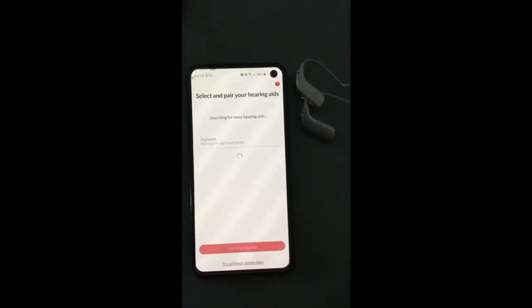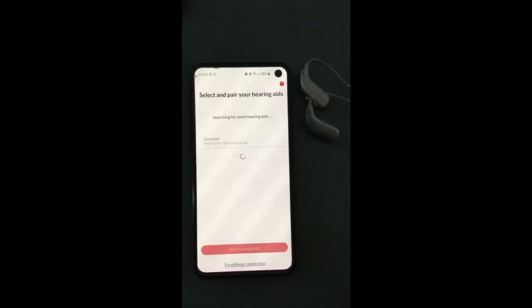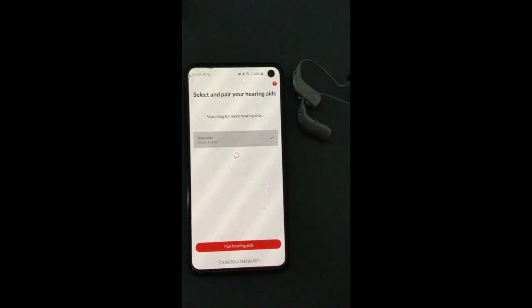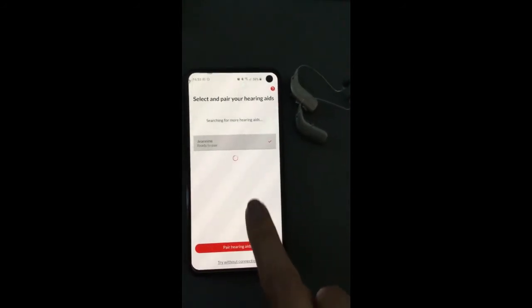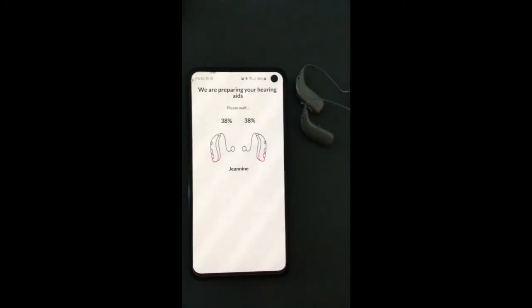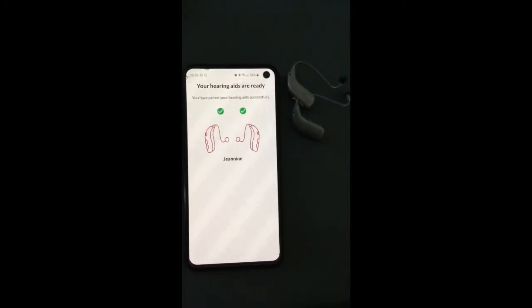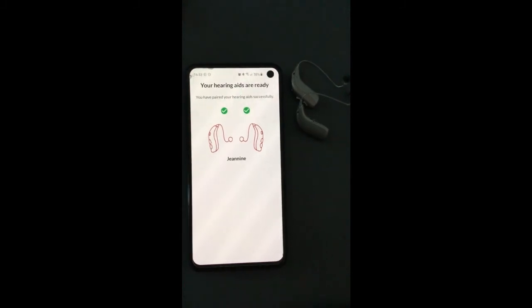Once both hearing aids have been turned on, the app should find them both — just waiting for the right side — there we go. Now they're ready to pair, so we're going to click 'pair hearing aids'. This will load up the app and you're all set up and ready to go.